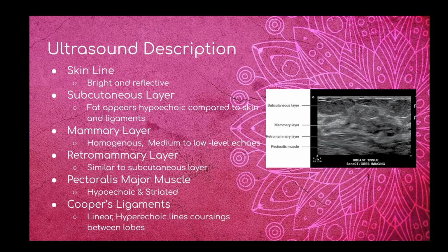There's something called a sebaceous cyst. It's a skin cyst or like a clogged sweat duct. And if you use that standoff pad, you can see that it's only within the skin. It's a great tool when you're looking at very, very superficial structures.